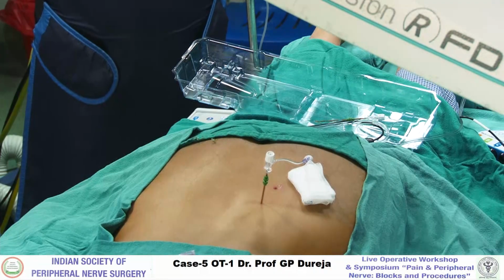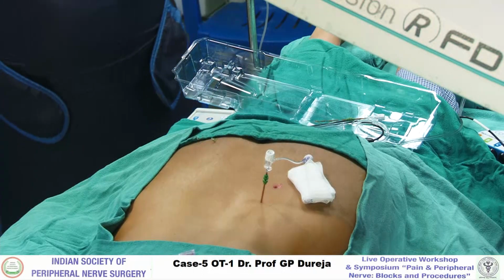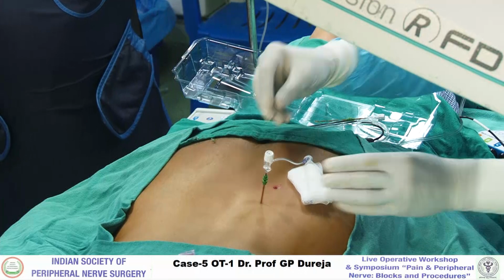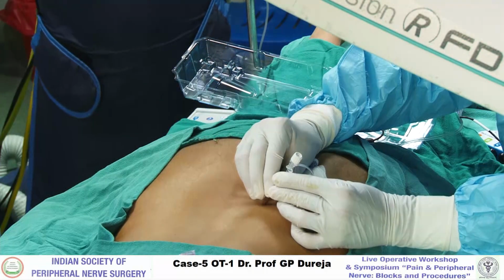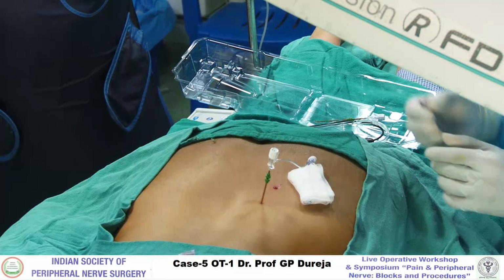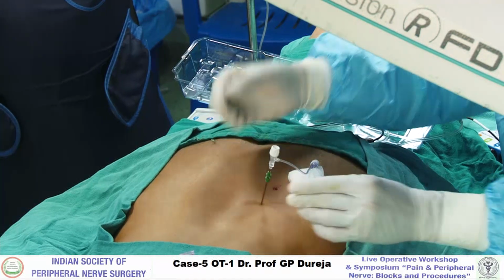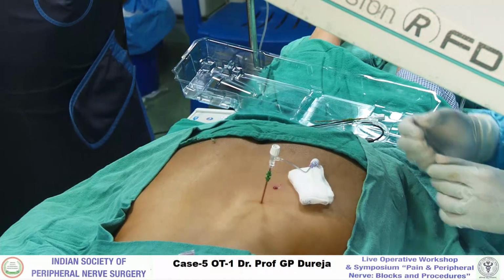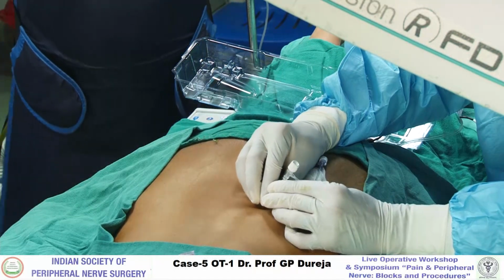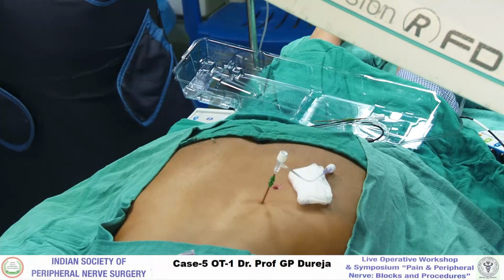So this is the RF needle, which has been put in at L4-5, costing 1,500 rupees, and the catheter which is ideally supposed to be disposable. You can do ETO. How many cases can we use it for, sir? Sir, in practice I do reuse it, but only two or three times, because the tip of the needle gets blunt. If you are doing trigeminal and you are hitting the foramen wall, you may cause some damage. So when you are having CSF and all, I don't reuse it, but 2-3 cases you can do.